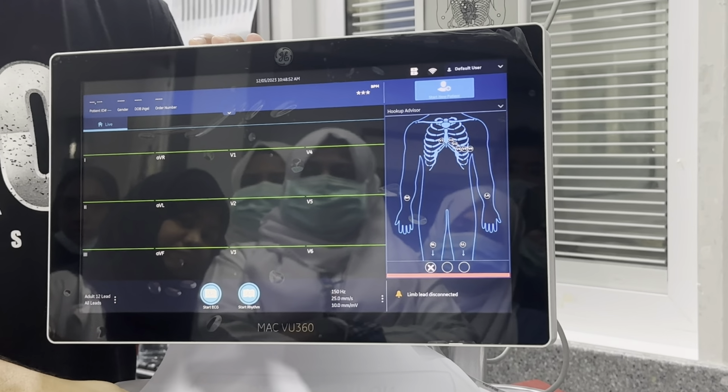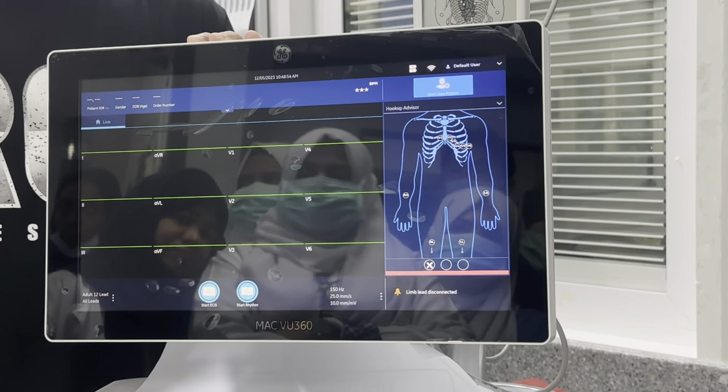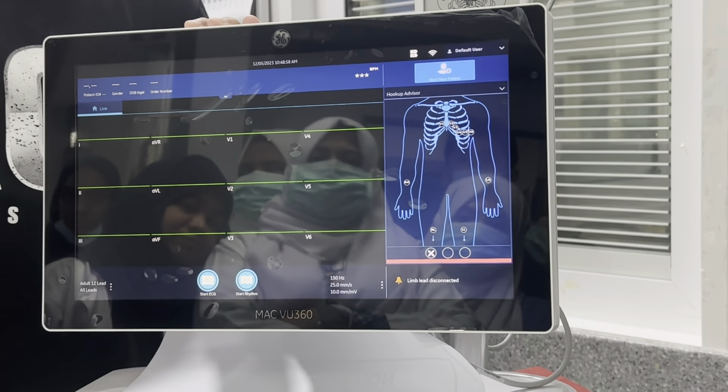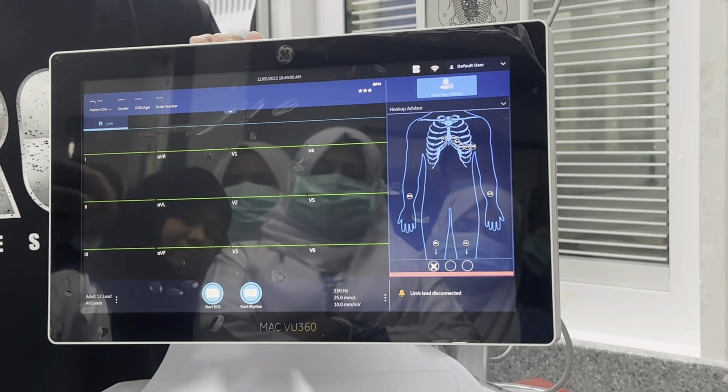If your patient or your machine is sitting next to a generator room, it will never be green, it will be yellow all the time. So only with these cases we can say that the yellow indicator is acceptable.